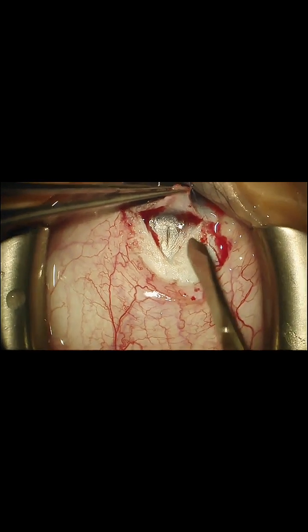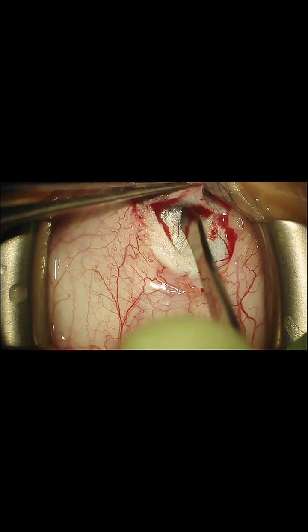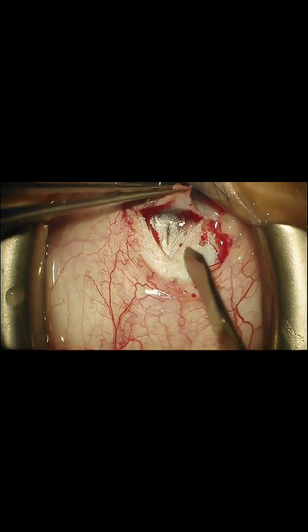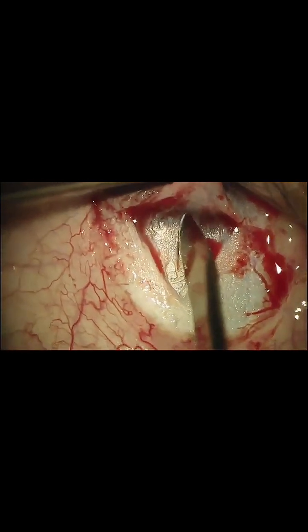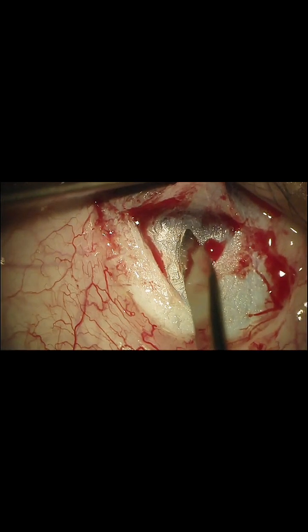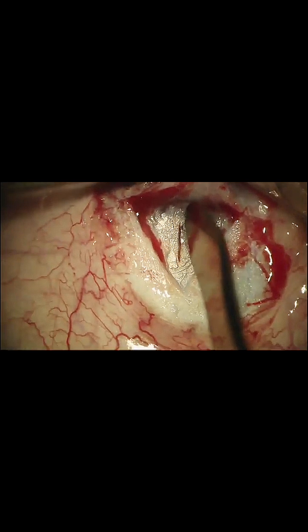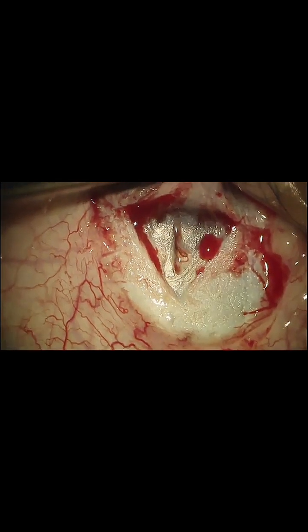And we're essentially just going to go down real slow until we start to see some aqueous come through this. A little fluid there.